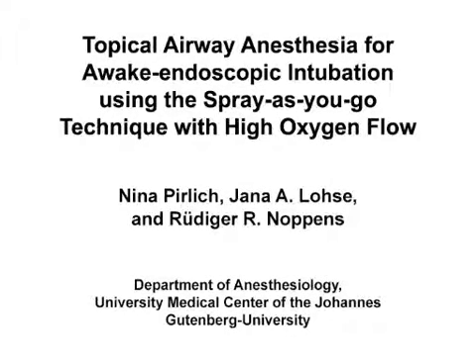The overall goal of the spray-as-you-go technique is to provide sufficient topical anesthesia during intubation, with higher patient satisfaction and better compliance than the classical bolus application of anesthetics. The main advantage of this technique is that the oxygen flow atomizes the local anesthetic into fine particles, which evoke less gagging, and therefore patients are more satisfied and cooperative. We had the idea for using this method when we were struck by patients complaining that the splash of the bolus striking the airway mucosa gave them the feeling of being drowned.